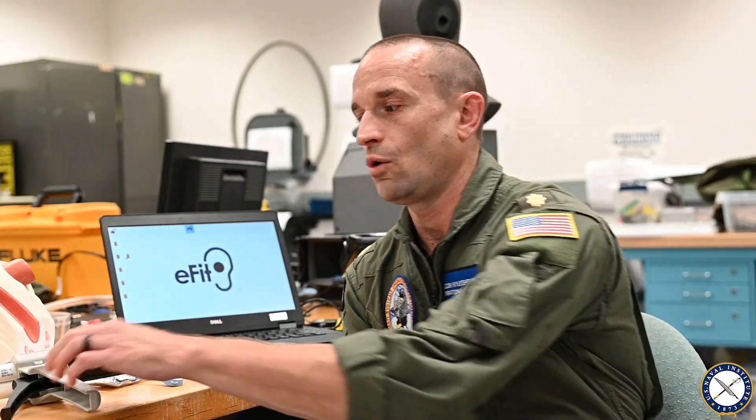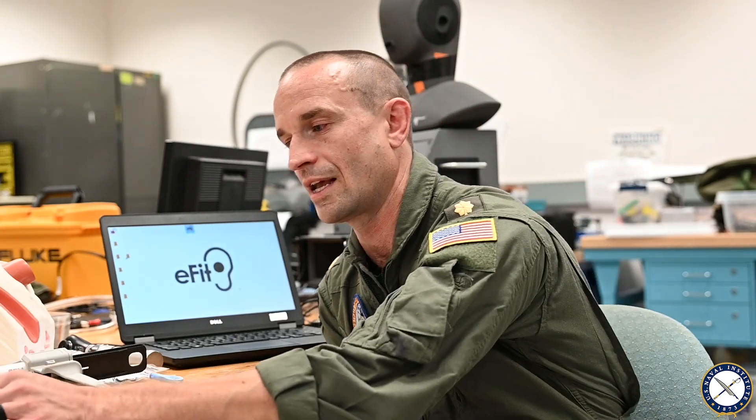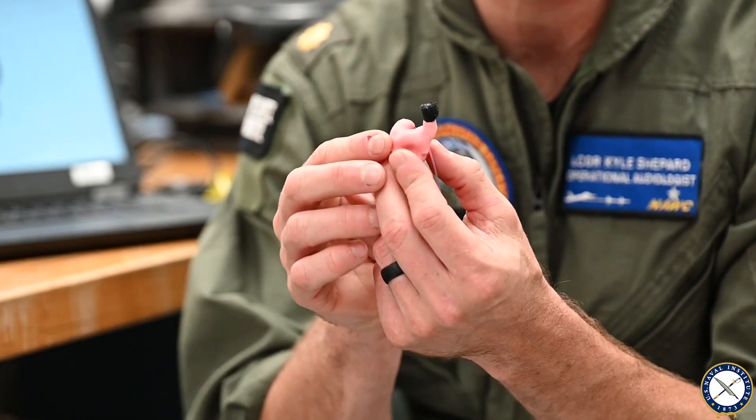We use a gun like this to place the silicone-based material in the ear canal. It sets up for about five or ten minutes and creates an impression like this that we mail to the manufacturer for them to scan and mail back to us to create a custom ear plug.